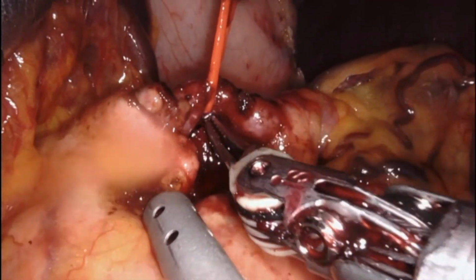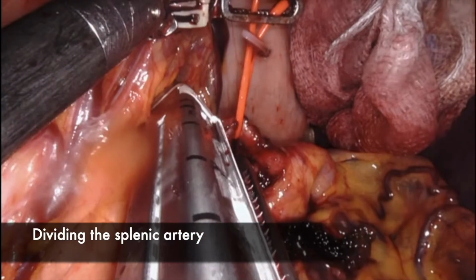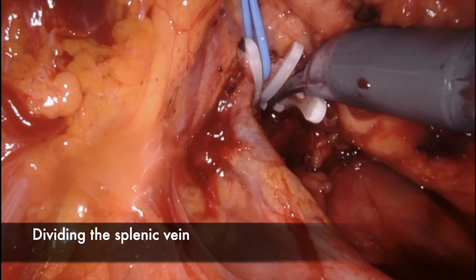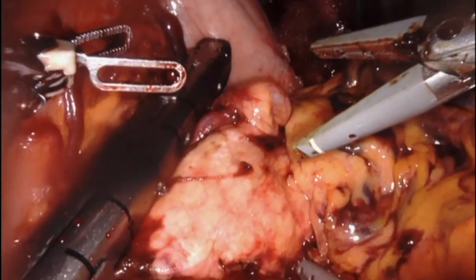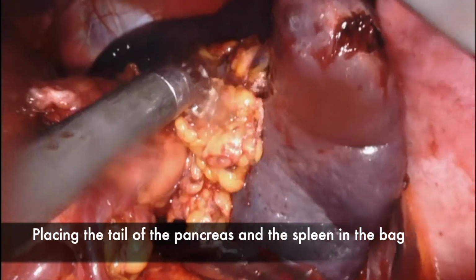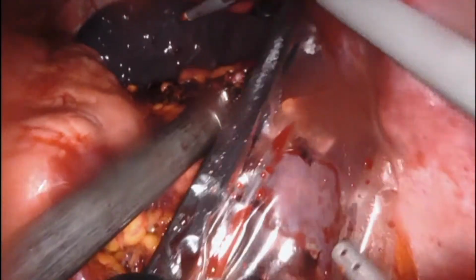Splenic vessels are divided using polymer clips and robotic endostapler. The pancreatic parenchyma at the junction of the body and tail is incised with an endostapler. Both surgical specimens are placed in plastic bags and then removed.